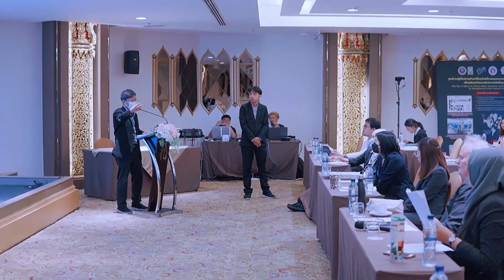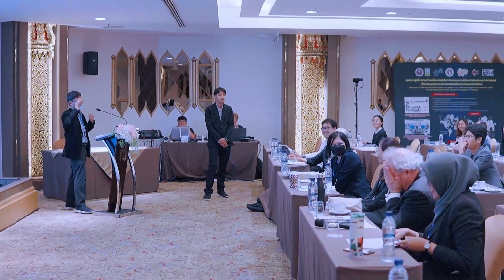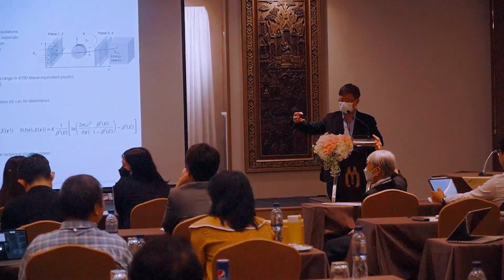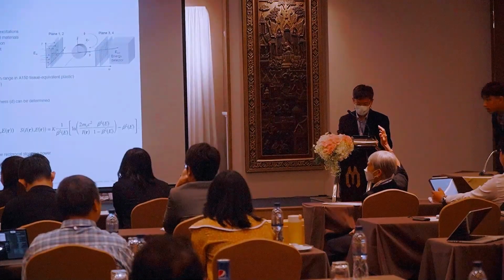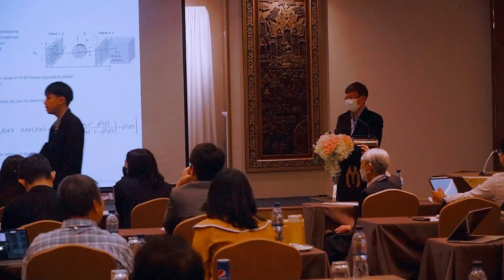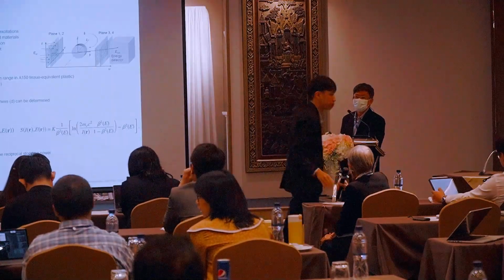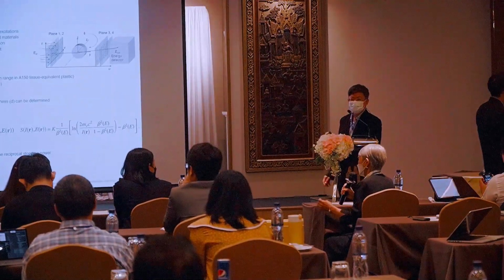So in short, you do two things. First, increase the energy of the proton. And the second one, just take the organ out, just like you did for the patient's eyes. You just cut it open and take it out. So you need a bigger cyclotron.